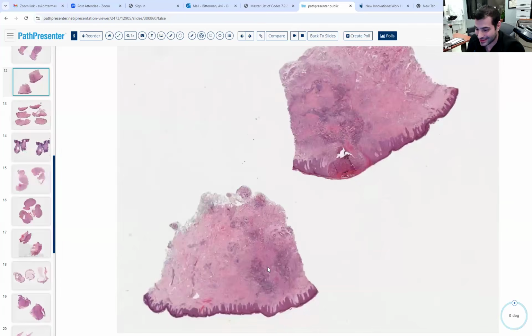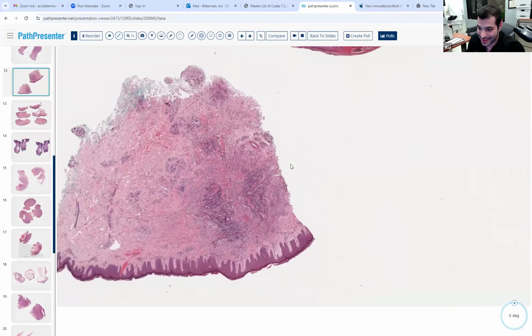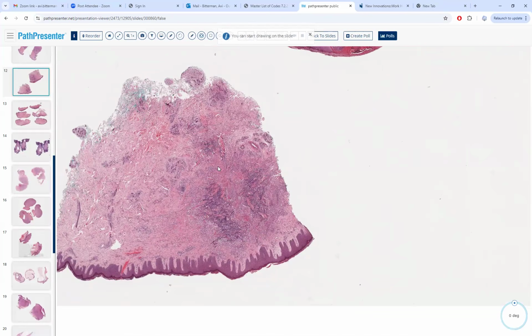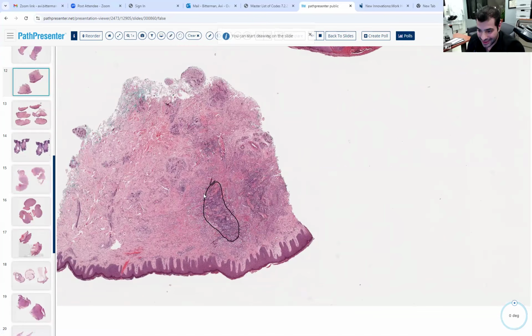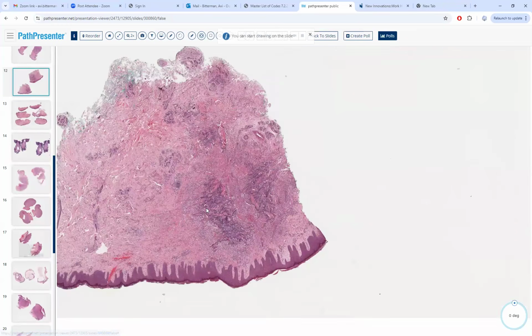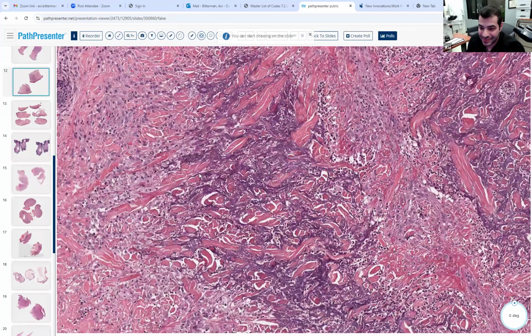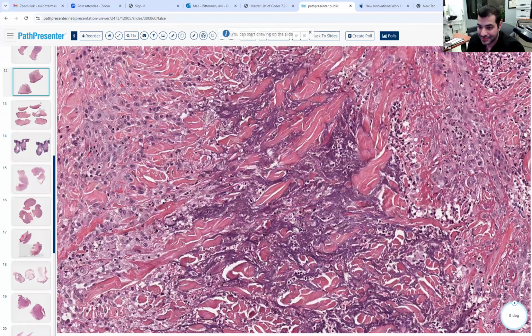As opposed to this, by the way, what is this? Punch granuloma. Is it palisaded? Doesn't look like it. Or is it circumscribed? And here are the histiocytes on the outside, the palisade. There's something else here too. Two other things.